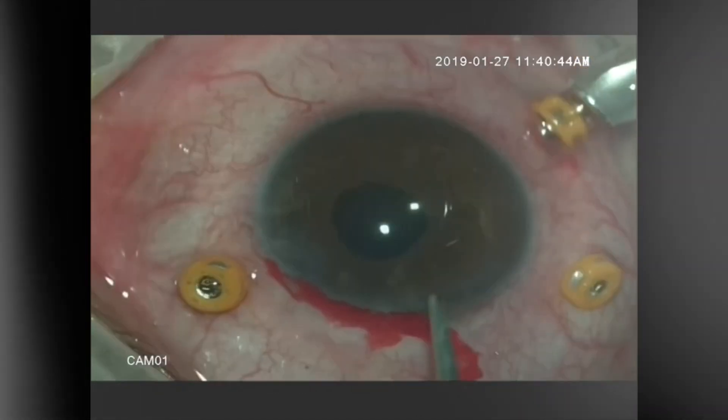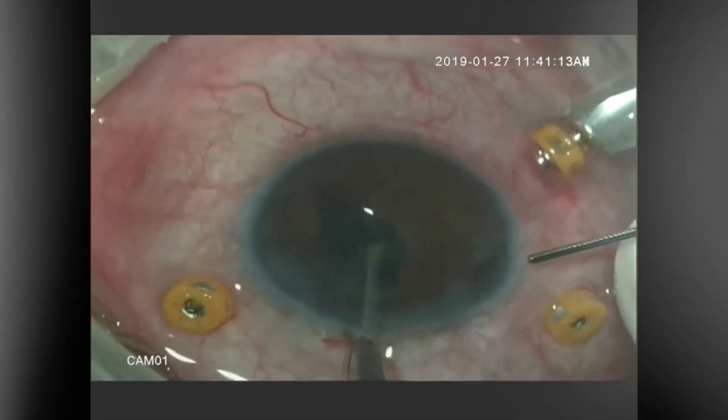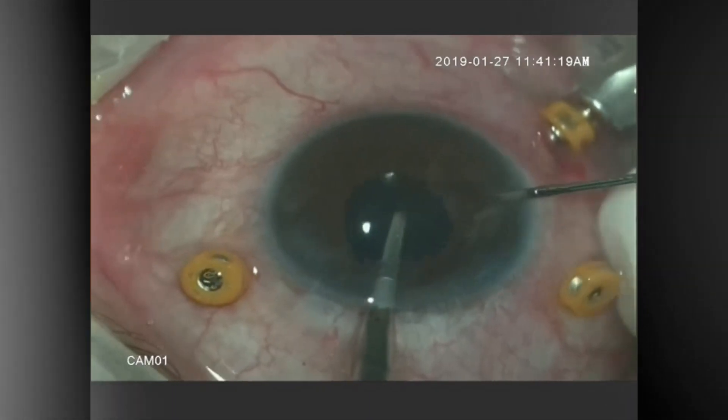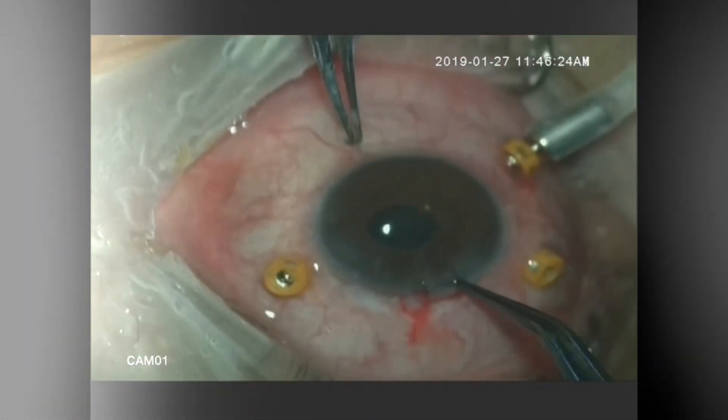After explanting the IOL, the iris-claw lens is then introduced inside the eye and will be fixed retropupillary.